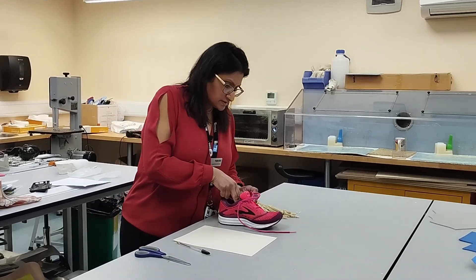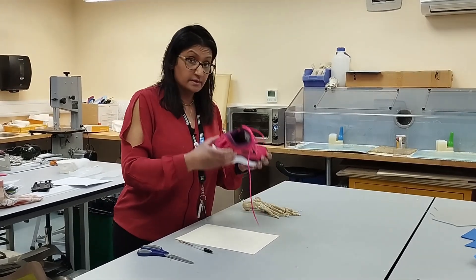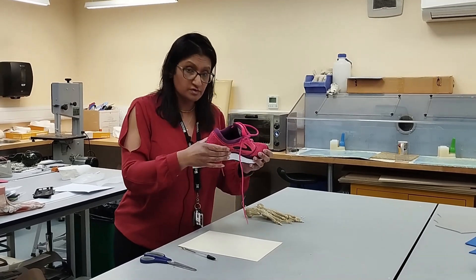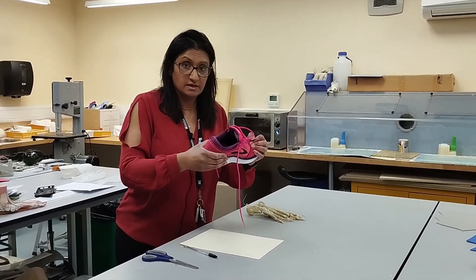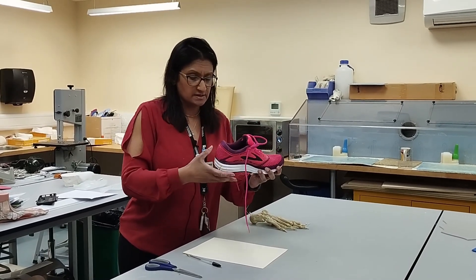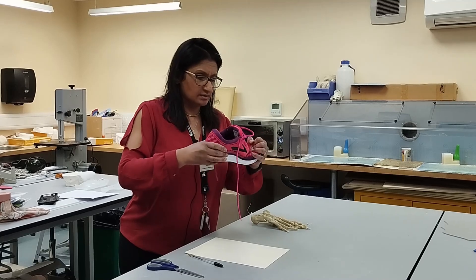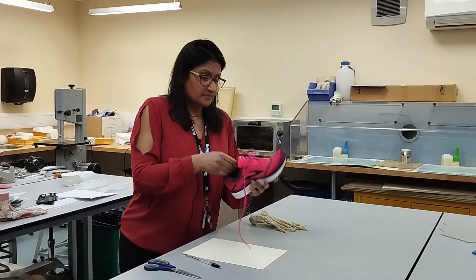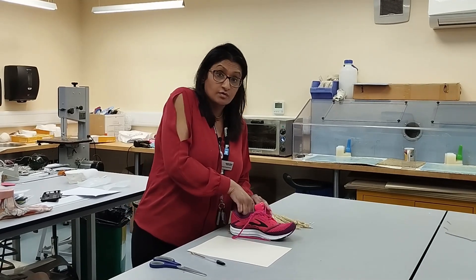The first thing we need to do is to assess the footwear and check that the shoe is correct. You won't need to do that for your OSCE station; however, if you're taking it in clinic, you need to make sure it's a good fit. You need to check rigidity, heel counter, flexibility, forefoot rigidity, and midfoot. Once the shoe is good, you're ready to go for an insole.